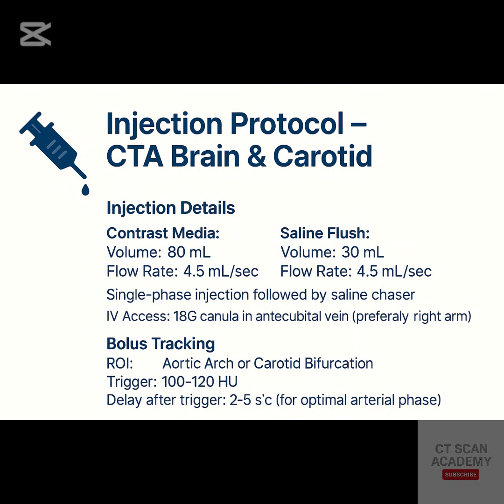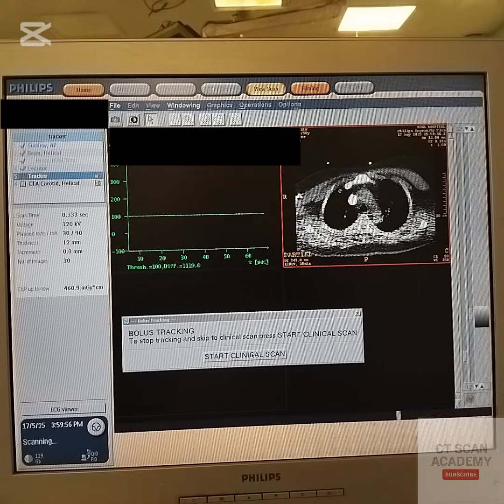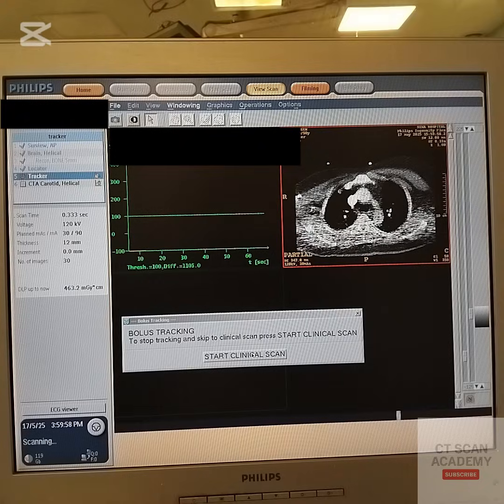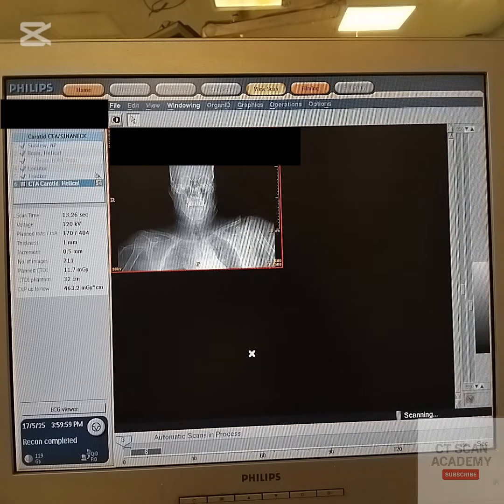Injector settings: 80 mL of contrast at a rate of 4.5 mL per second, followed by 30 mL of saline chaser at the same rate. The post-injection delay is set to 7 seconds, allowing contrast to reach the aortic arch. When contrast is visualized in the arch, the scan begins.